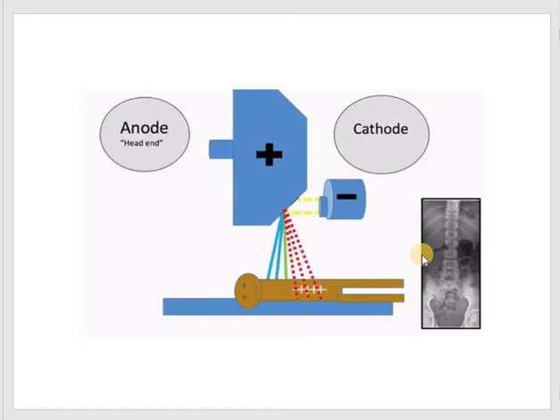The heel effect can be used to advantage if the cathode portion of the beam is placed over the thickest part or the higher density part of the patient. And it's good to note that the heel effect is less noticeable with smaller film size and longer tube distance, because more of the central uniform portion of the beam can be used.